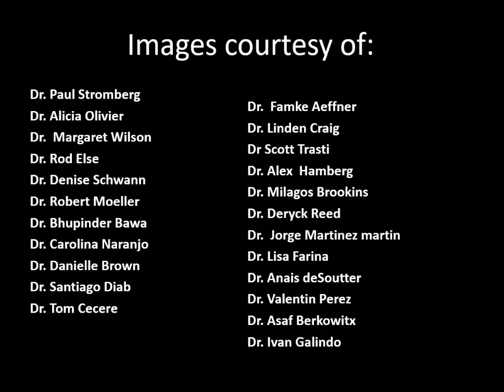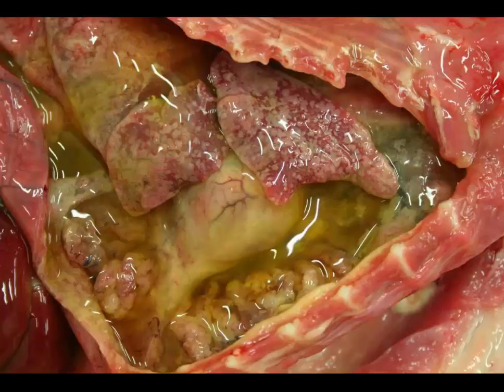So let's go ahead and get prepared. Get your paper, your pencils, your pens, whatever you want to use. Give yourself 60 to 90 seconds per question, and let's begin. Slide number 1 is an absolutely beautiful picture from a cat. What I want you to do is give me the morphologic diagnosis and a cause.